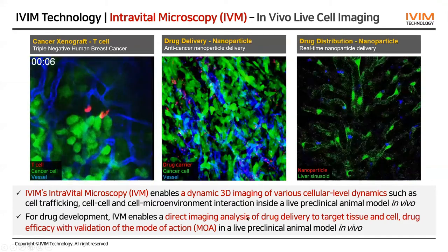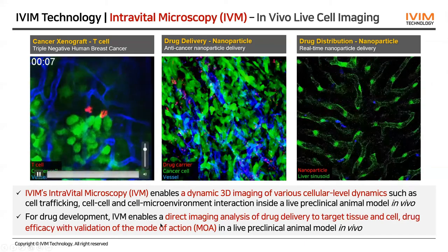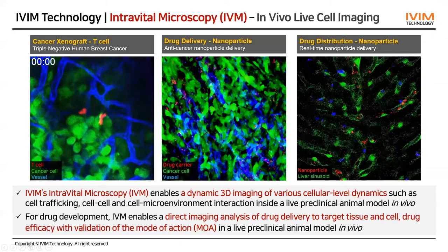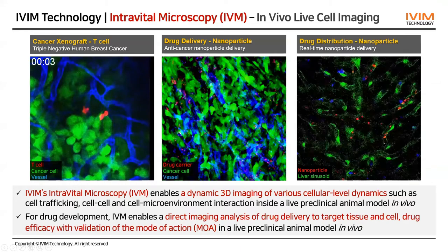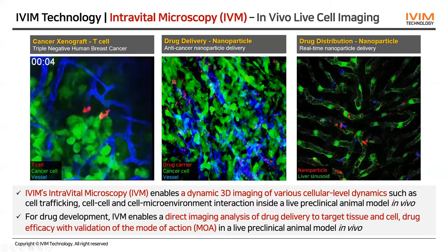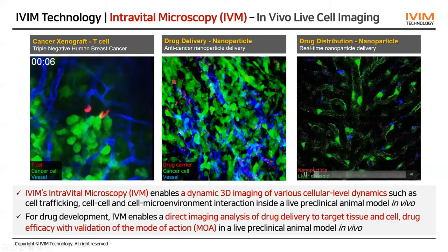And then also for drug development, intravital microscopy can enable direct imaging analysis of drug delivery, as shown here in the middle, to the target tissue and cell. And this is the real-time video of the nanoparticle flowing in the blood vessel in the liver after the intravenous injection of this nanoparticle.